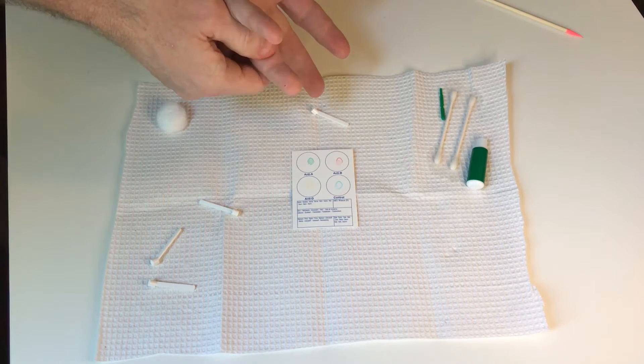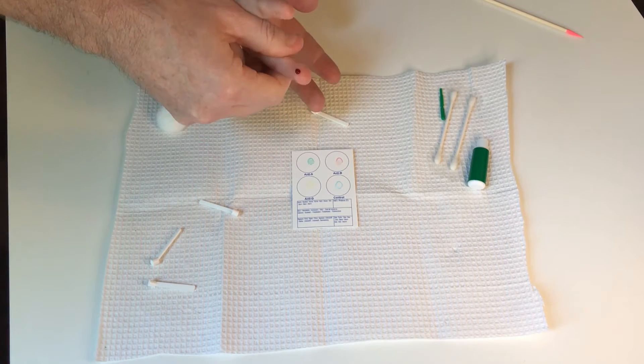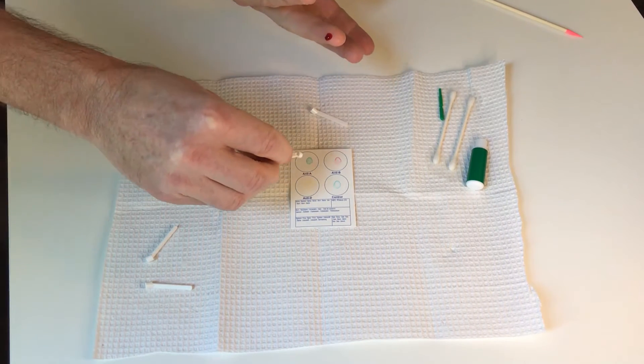Now I've got to just kind of milk it. Oh, that's a good one. I'm a bleeder today, so there's a nice big blood blob.